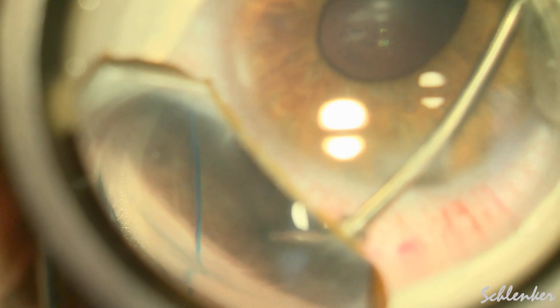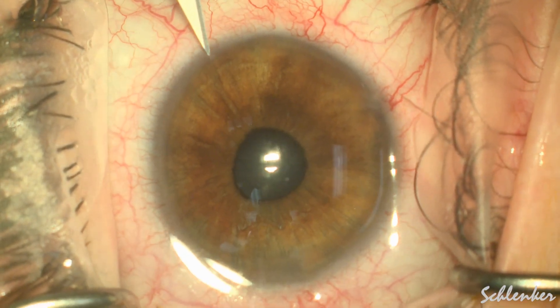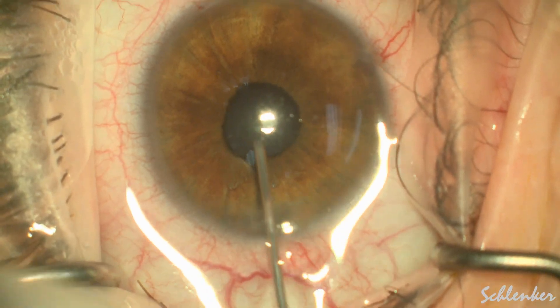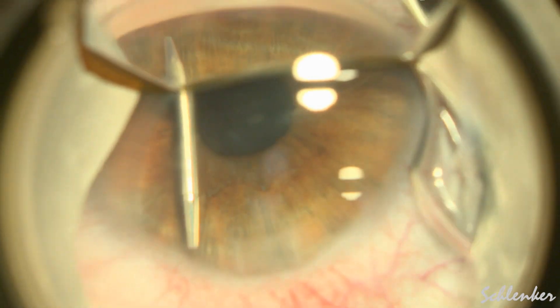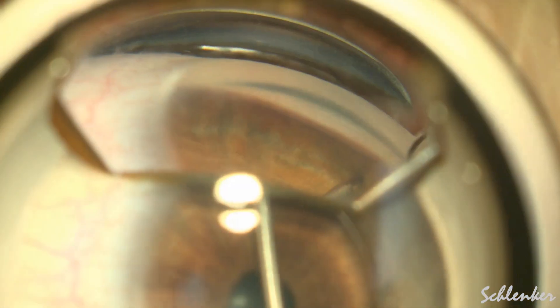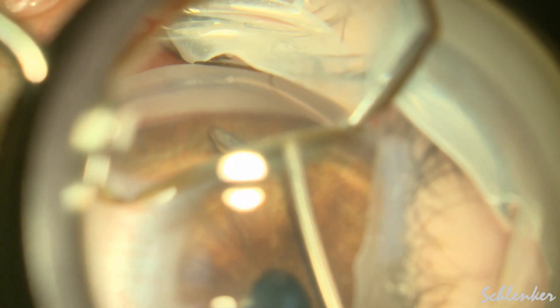Often I use a 25-gauge micro forcep to grab onto the peripheral iris and pull it down. This lady was in considerable discomfort during this — topical and without a block — but you can see that just using a blunt cannula, and here I am using some 23-gauge micro-graspers which I was going to use for the GATT anyway, just using the blunt tip to gently tease down this peripheral iris. You can see it was working quite well, and we were able to just talk to her during the process and tell her that everything was going very well.